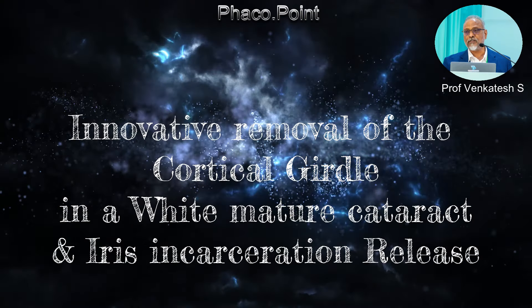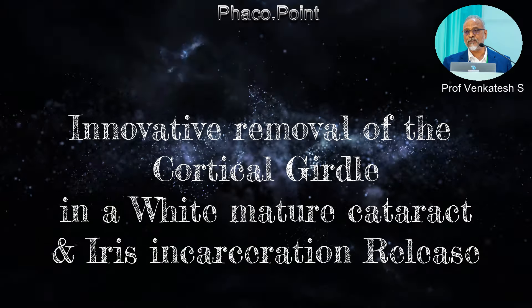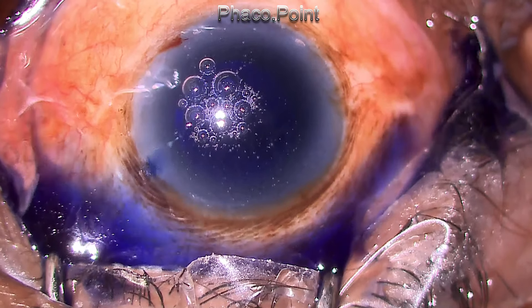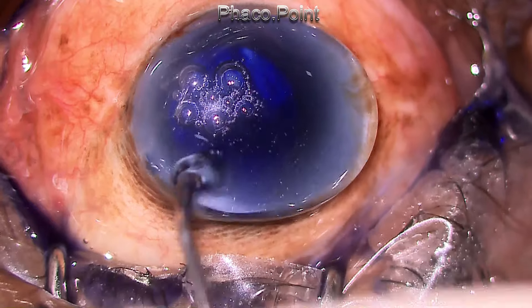This video is about the management of a white mature cataract. In this particular case, there was a lot of difficulty in trying to remove the inspissated cortex. It also shows how to release an iris prolapse that occurred during the later stage of the procedure. The case gets started with adequate staining of the anterior capsule.